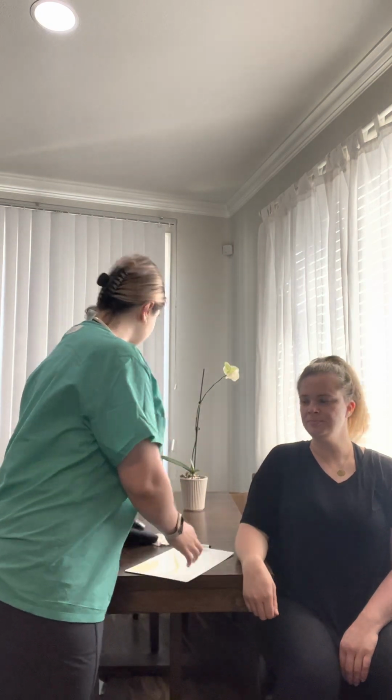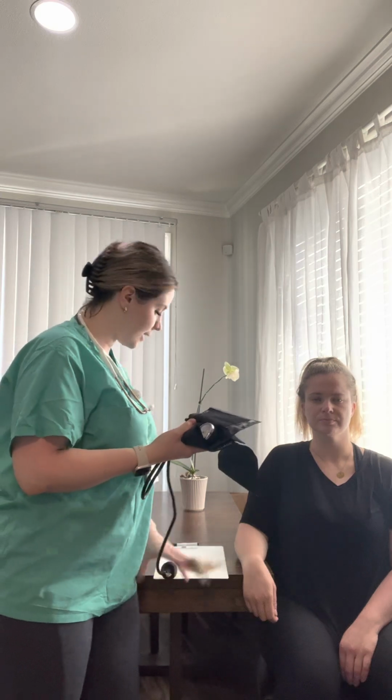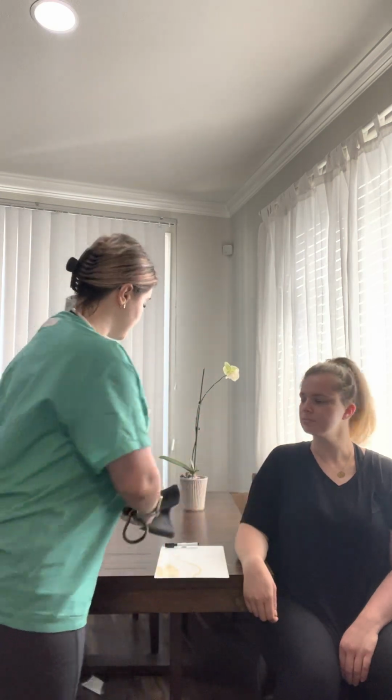Before we begin, we do have to make sure we have all of our supplies: our badge, our watch, our stethoscope, our whiteboard to record our findings, our blood pressure cuff, as well as a sanitizing wipe.